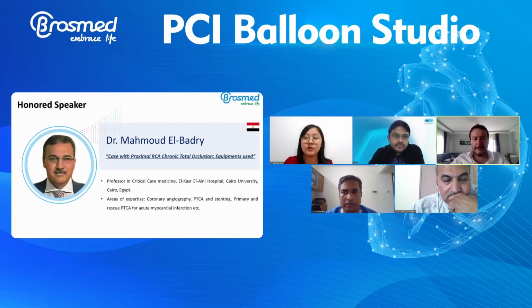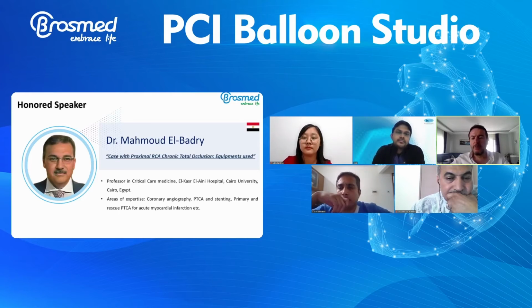I just want to say, keep doing the good work with these balloons. About the NC wedge, there should be a way to have an FDA approval for the NC wedge balloon that we use, which is designed for peripheral intervention.